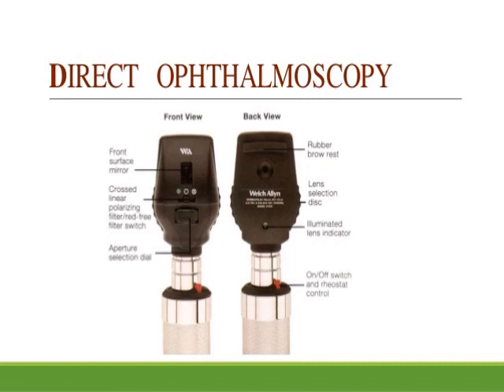The direct ophthalmoscopy should be performed in a semi-dark room with the patient seated and looking straight ahead, while the observer is standing or seated slightly over the side of the eye to be examined. The patient's right eye should be examined by the observer with his or her right eye, and the left with the left eye.